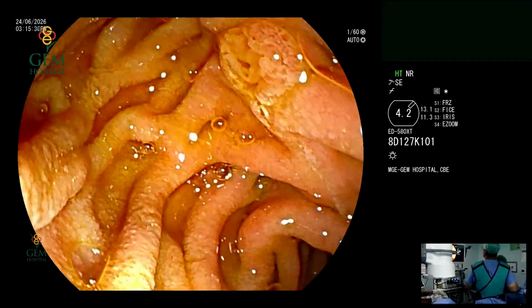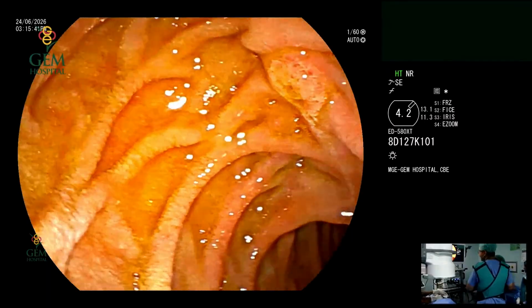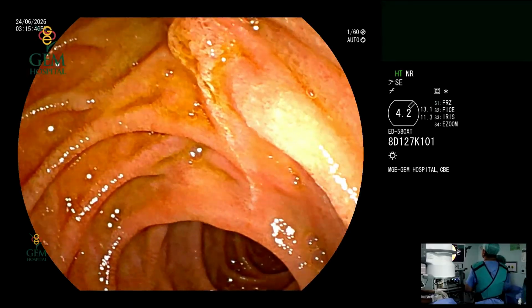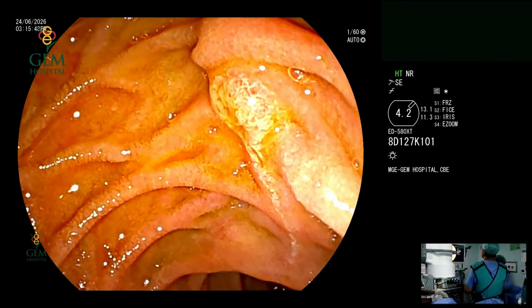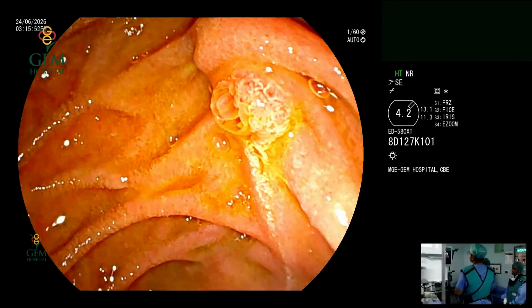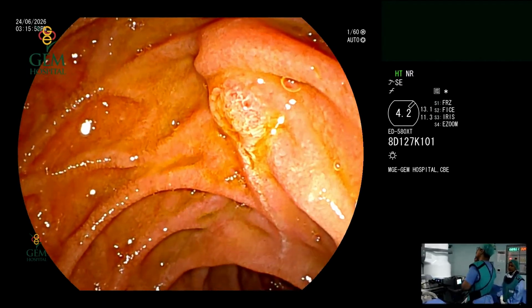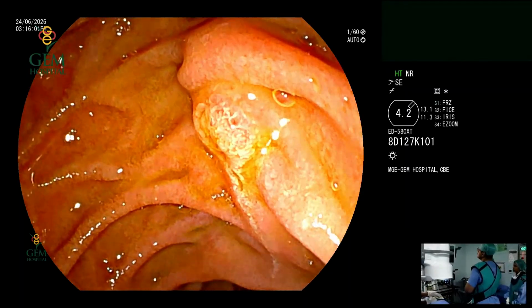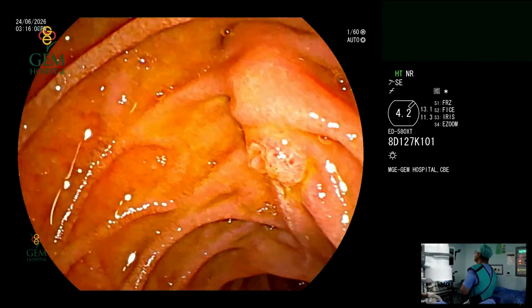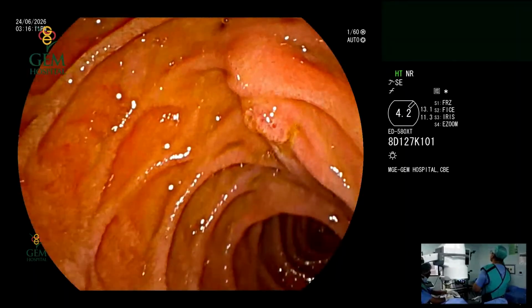Okay. So the first step of ERCP will be to identify the papilla. After you've gone to the D1, D2 junction and reached the D2, make sure your papilla is visible and in the upper right quadrant of your screen. If you divide the screen into 4 quadrants, try to keep it in the upper right quadrant of your monitor. So this is where it is. If you keep it more central or towards the left, there is always a chance your accessories might not come in the right way. Neither go too close nor be too away.